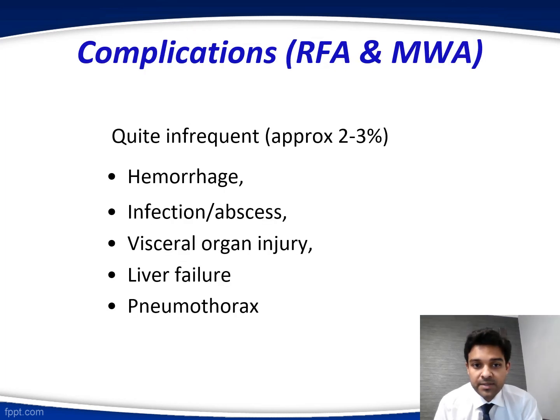Let us now talk about some of the complications for both RFA and microwave ablation. It's quite infrequent, approximately 2 to 3%, but some of the complications would be hemorrhage, infection and abscess, visceral organ injury, liver failure, and mostly pneumothorax in lungs.